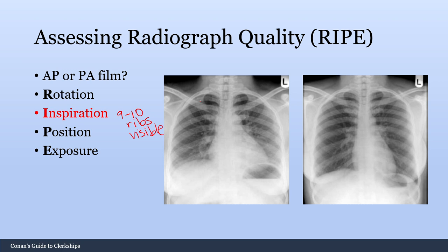To count the ribs, first find the first rib, which curves back around and loops at the top. Then count down: 1, 2, 3, 4, 5, 6, 7, 8. For the patient with a better inspiration, you can count all the way to 9 and 10, confirming this is a good quality radiograph.